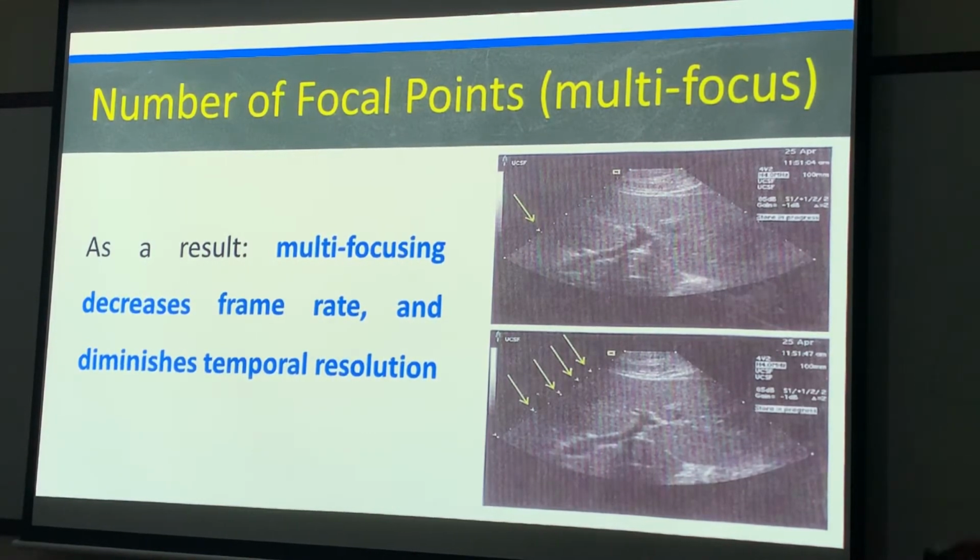Is that an option? Yeah, it's an option. I have a video of it coming up actually. YouTube said that there's no difference between the first and second. No, you can't tell on here. I'm sure on the actual machine there was a difference, because remember, we're changing our lateral resolution right here. We're improving lateral resolution. I've never had a machine where I had 5 focal zones going though. I never had the need for that. But this is just an example.